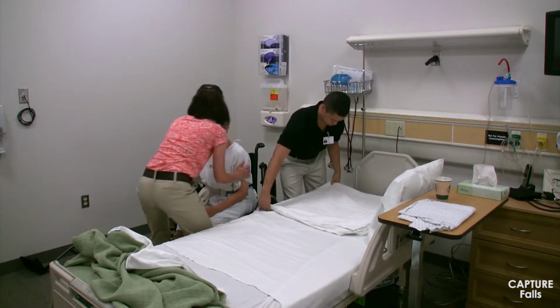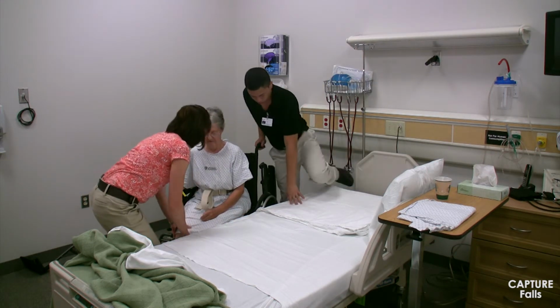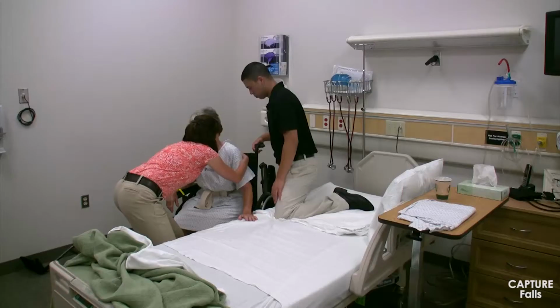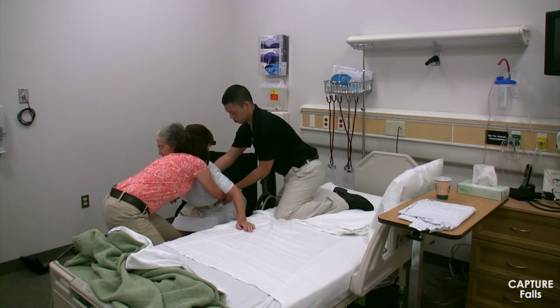He should place one foot in the space between the bed and the wheelchair. With the other leg, he should kneel on the patient's bed after first placing clean linen there for infection control. He should grab onto the gait belt and lean forward at his hips while maintaining the natural curves of his back. Instruct the patient to lean her trunk forward and to push through her arms and feet to slightly raise her hips off the chair.